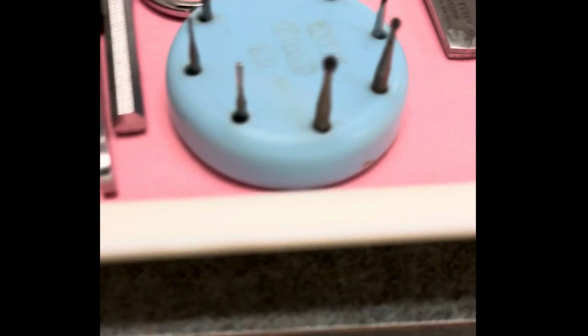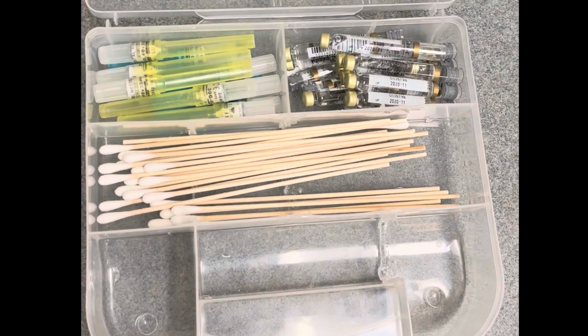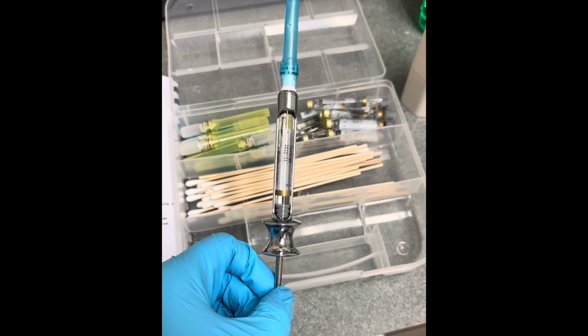We're going to start off with spreading the anesthetic gel on the tooth to make sure it is numb before we go ahead and have an anesthetic. We'll use these giant applicators. This is the syringe we're going to use to help numb the tooth.